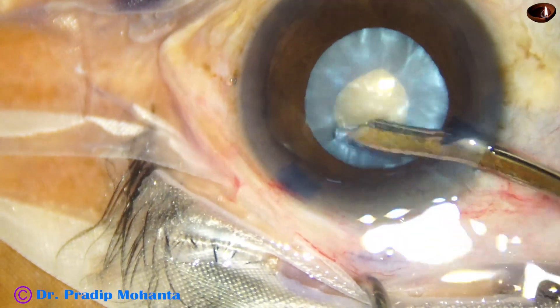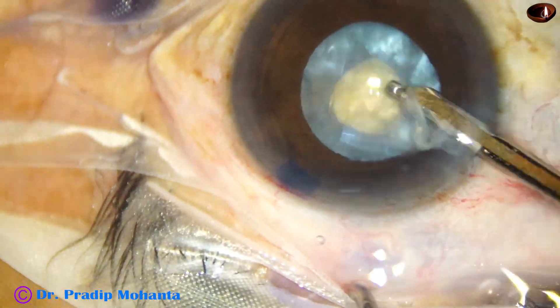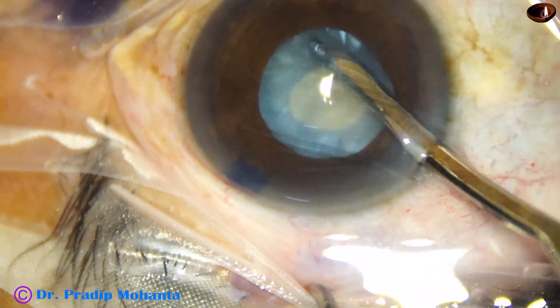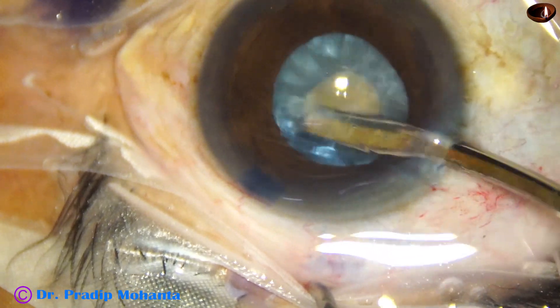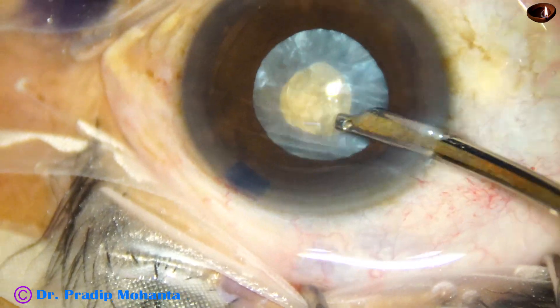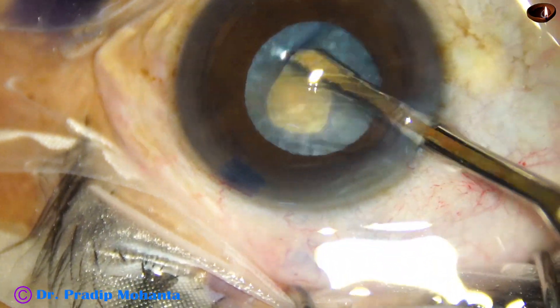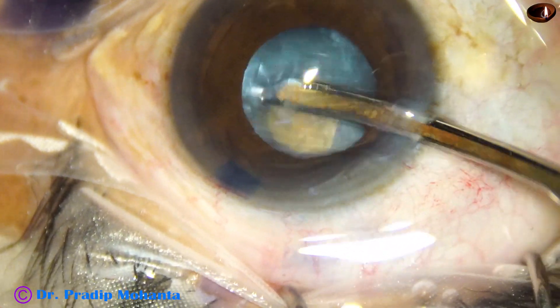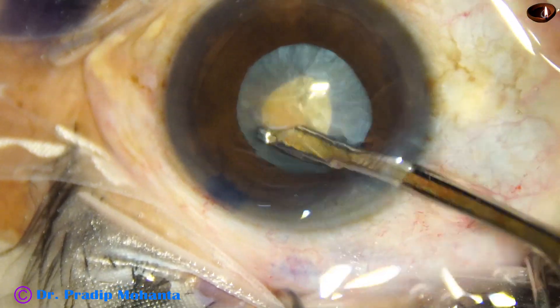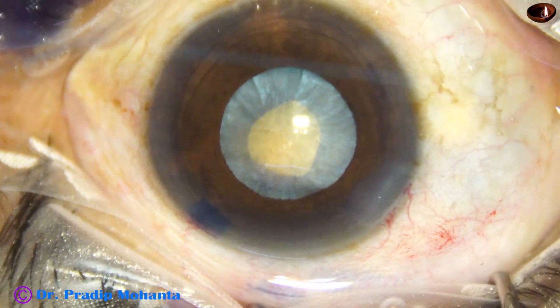The CCC flap is converted into a small rhexis. Now I am using this cannula — this is a two-way Simcoe — and irrigation-aspiration is occurring, removing some cortical lens matter from the capsular bag. Thus, the intralenticular pressure is drastically reduced. This is done for quite some time so that there is no elevation of the anterior surface of the lens.